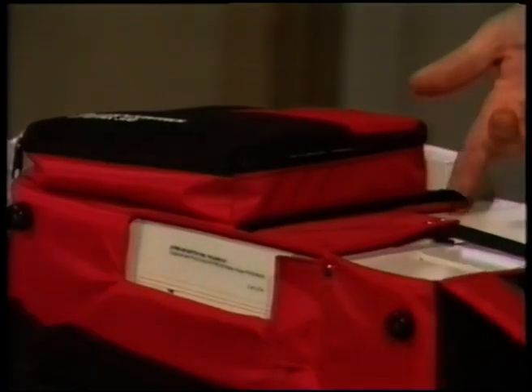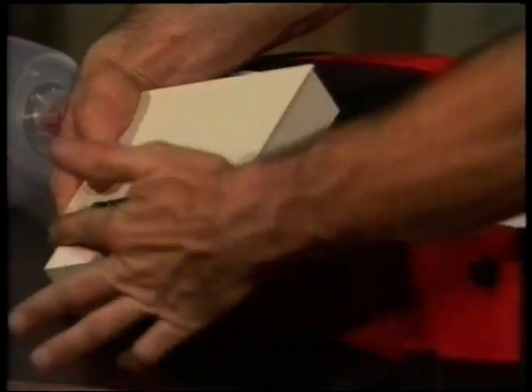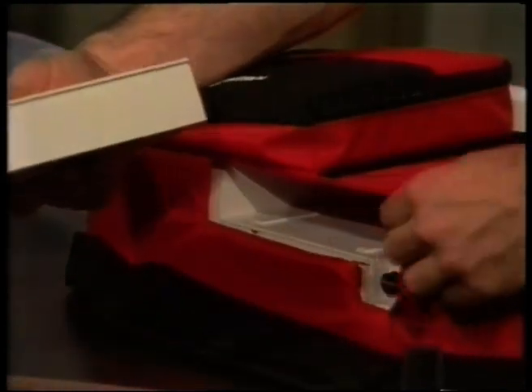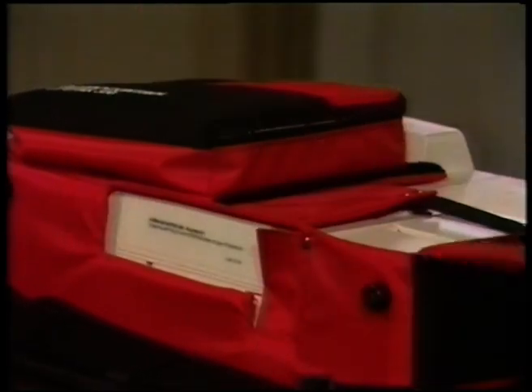To remove the battery, lift the battery release latch, grasp the rear of the battery pack, and slide it to the rear. To install, push aside the protective flap on the carrying case and slide the battery pack forward until the battery latch snaps into place.